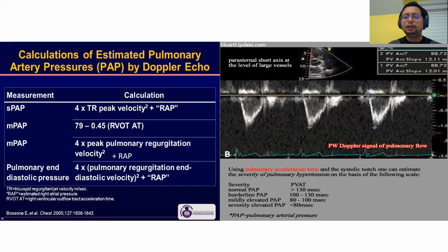However, the real diagnosis of pulmonary hypertension is done in catheterization of the right heart. The definition is mean pulmonary artery pressure more than 25. So what we do is we screen using an echo. Anyone with systolic pulmonary artery pressure more than 40 millimeters of mercury, send them to right heart cath to establish the diagnosis of pulmonary hypertension, then you can follow them up with echocardiogram. You don't need to do right heart catheterization anymore, right?